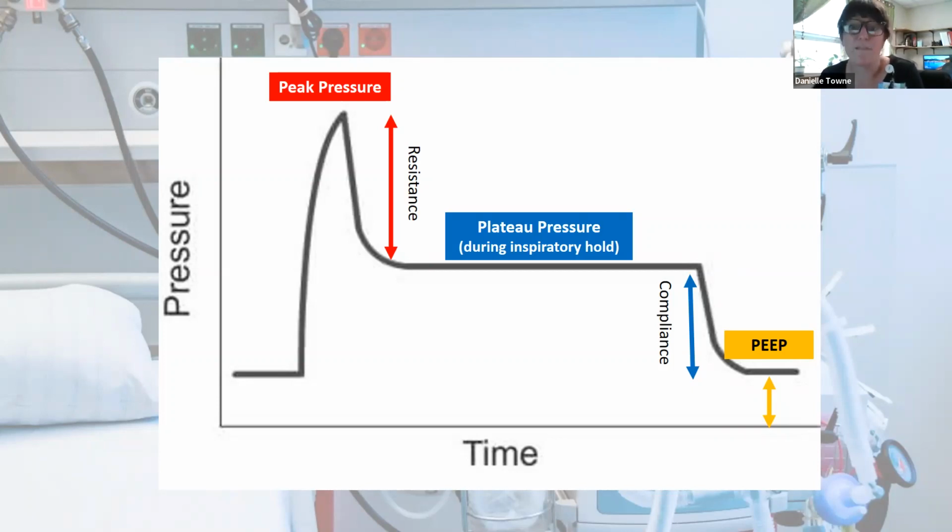Now, the PIP should never be above 40 without attempts to try and bring it down. We either make some changes to our vent settings, better sedate our patient, use medications like albuterol to open up airway passages, or fully sedate and paralyze. Now, some patients, like your severe asthmatics and those with ARDS, might be above 40 despite maximum intervention. You still want to do the best that you can to bring that number as close to or below 40 as possible.